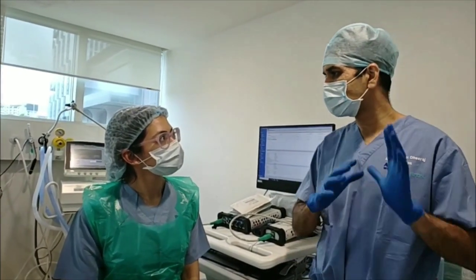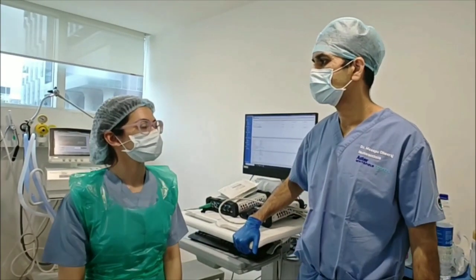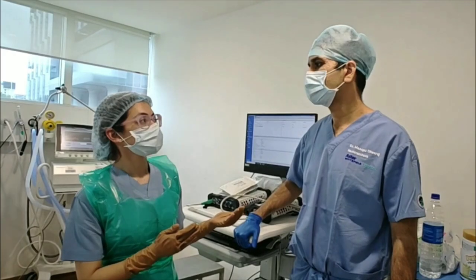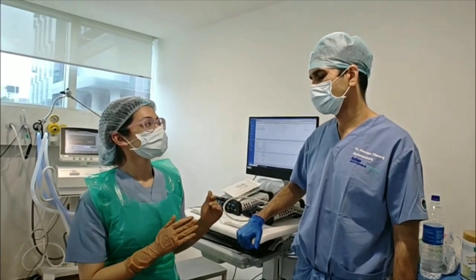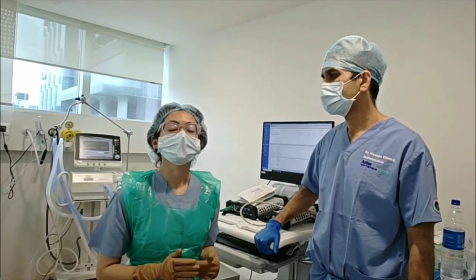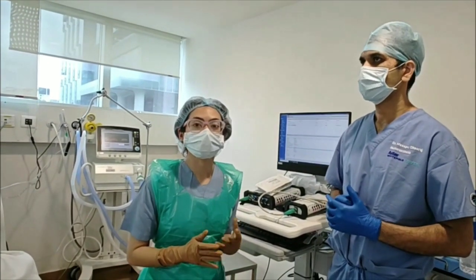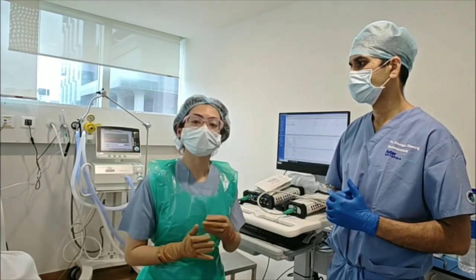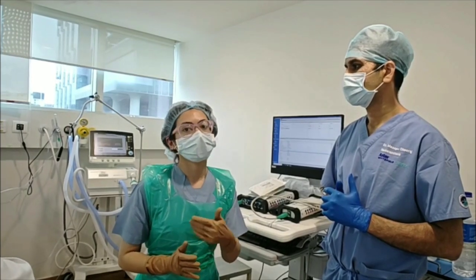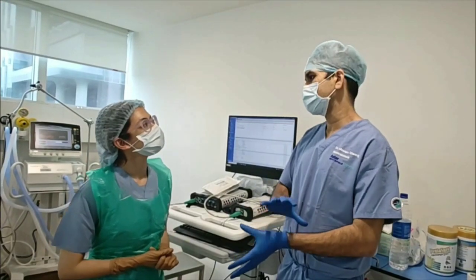Yes, some differences I encountered: there will be more artifacts compared to the OT because the patient may be more awake. We actually encounter two types of artifacts — physiological and non-physiological. Physiological artifacts come from respiration, movement, or glossokinetic artifacts. Non-physiological artifacts come from nearby machines that can interfere with the signal being averaged.